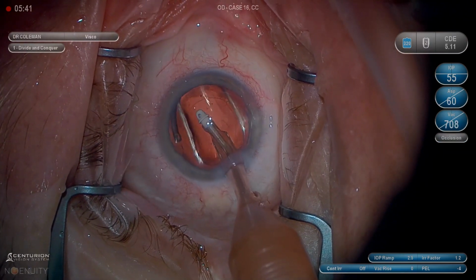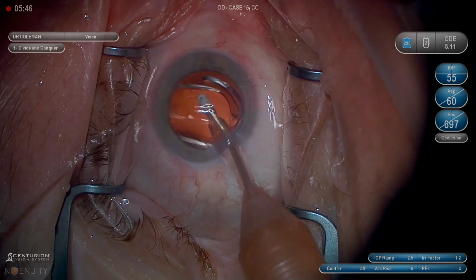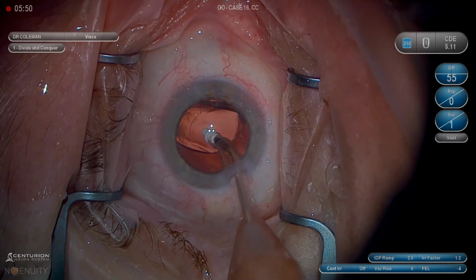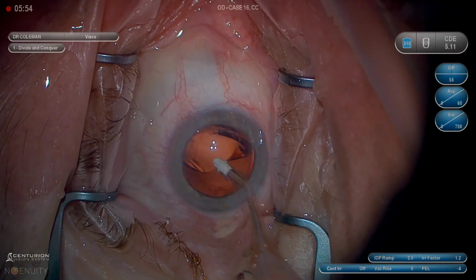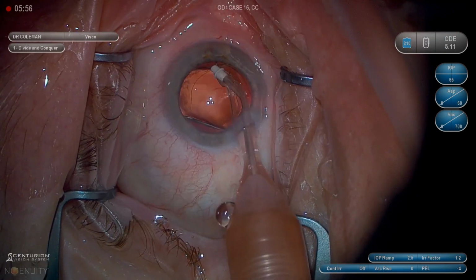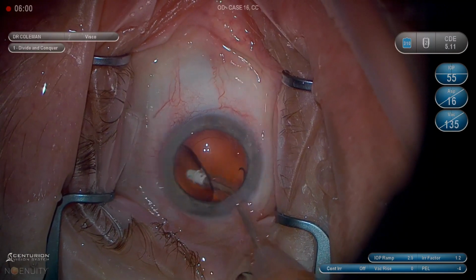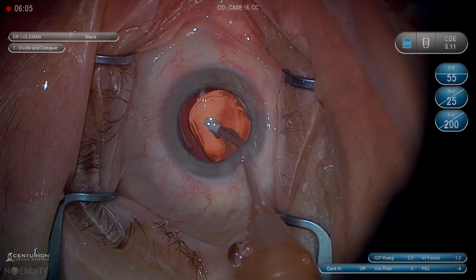It's important while you're doing this not to push down, because pushing down burps the wound. So we want to be in a real neutral position. We don't want to lift up. We don't want to push down. We don't want to ram the cannula in there so hard that the eye has a lot of movement to it. But we still want it pressed into the stroma enough that it's a very good, definitive, seated position before the hydration starts.